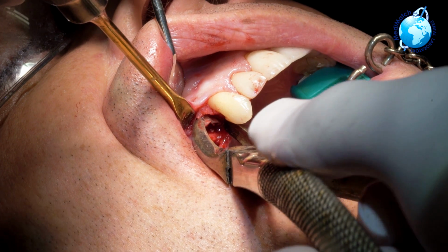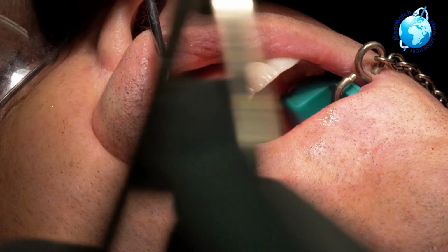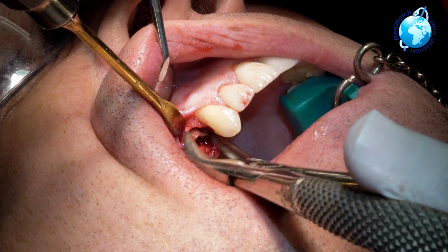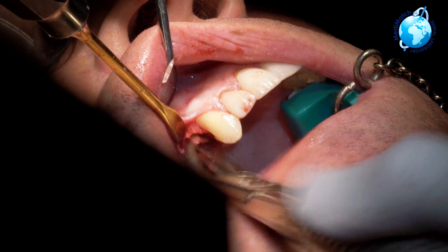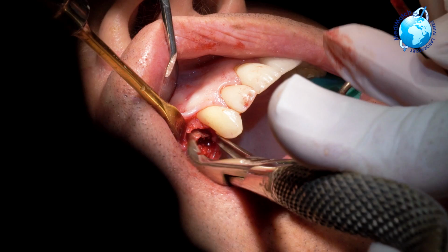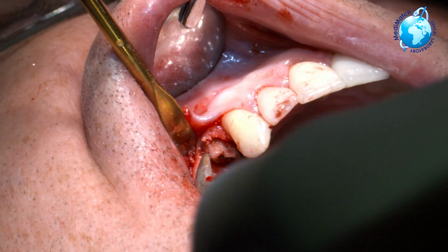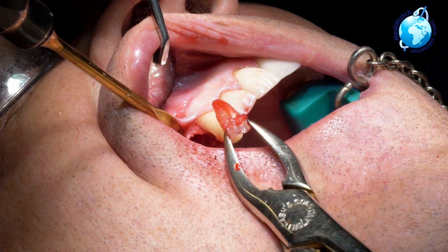And then we're just going to. You got a finer forceps at all? Yeah. Give me the baby. Yeah, we have the babies. Might be able to tooth this in, and just hold it. There we go. And we kept that buccal plate pretty much intact.